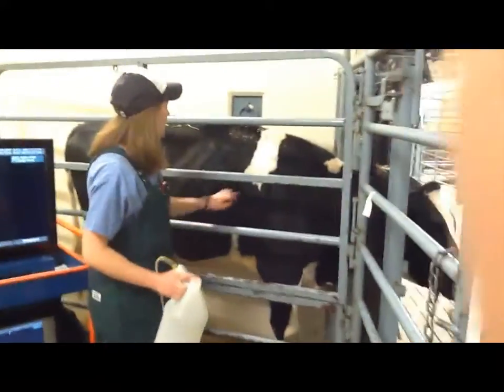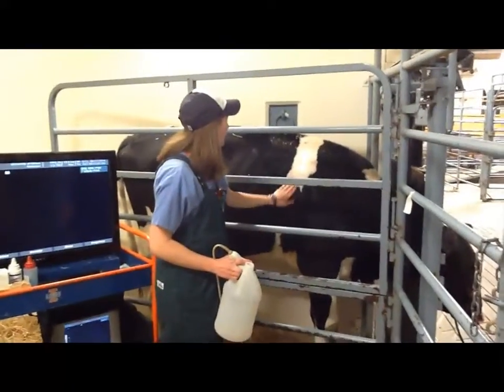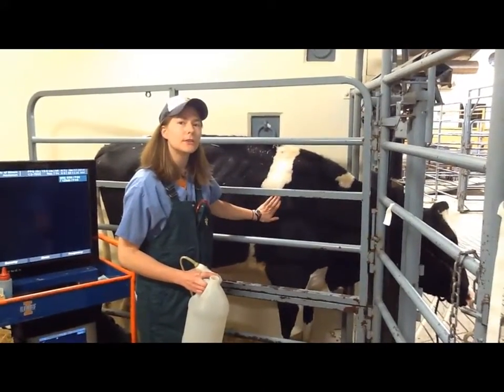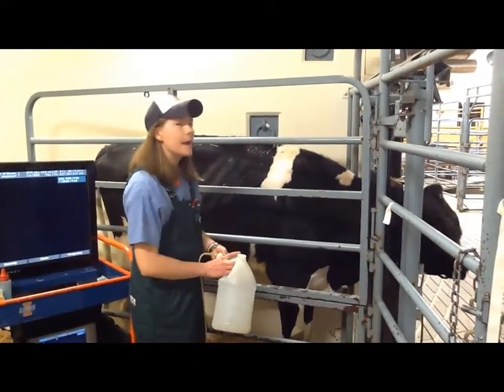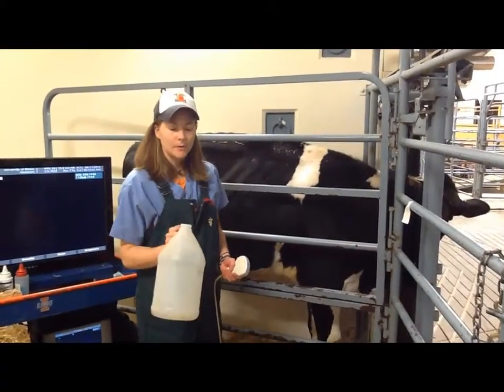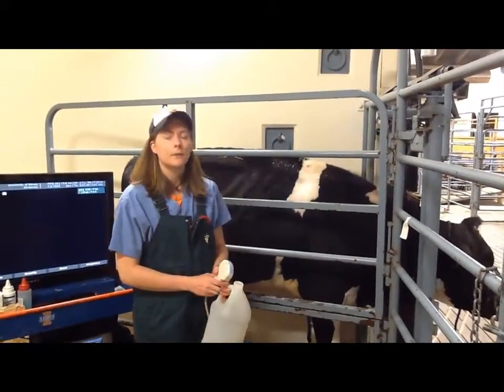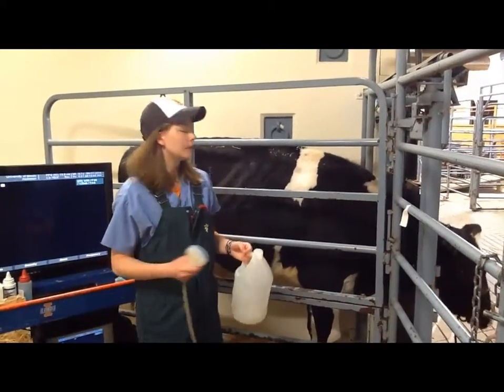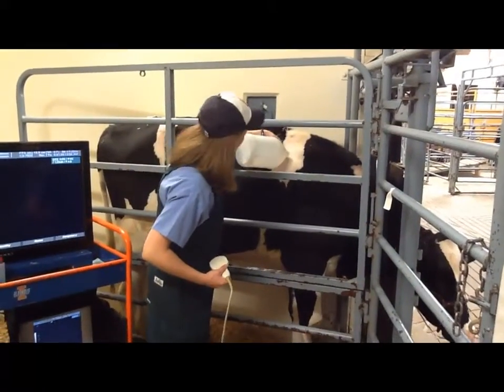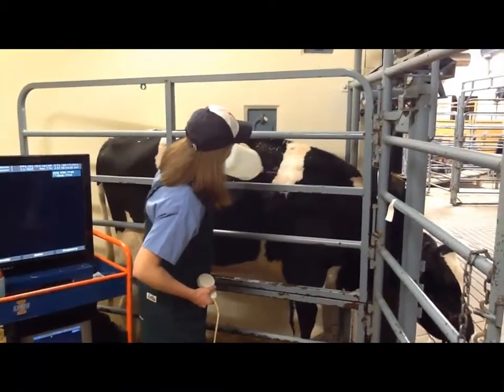When we're going to do an ultrasound, you might want to clip the animal so you can get a little bit deeper. But she's got some pretty thin hair, so we're just going to leave her as is. The second thing you need is some kind of medium for the ultrasound. Ultrasound uses sound waves to penetrate into tissues, and all waves need a medium to travel through. Today we're going to use some alcohol — you can use lubricant if you'd like. So we're just going to put some alcohol over the fields of interest.